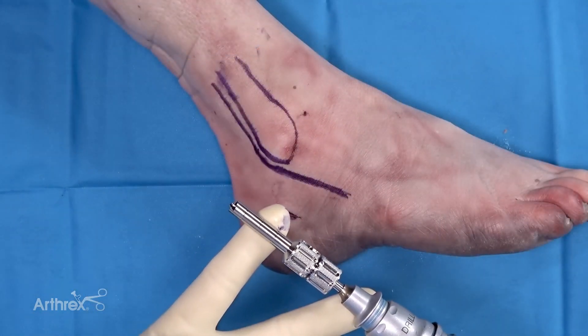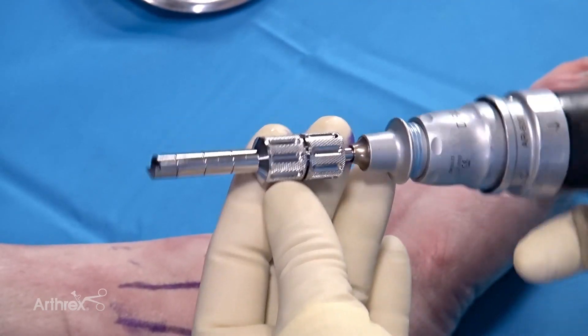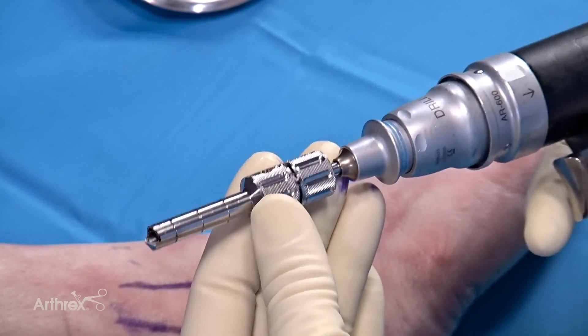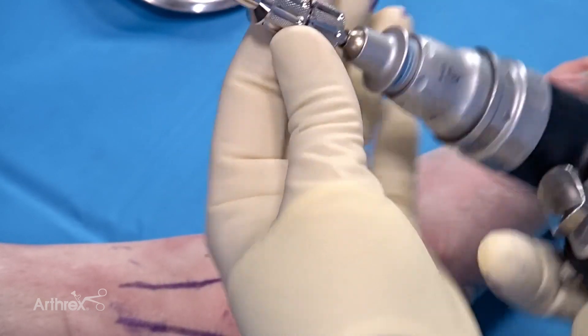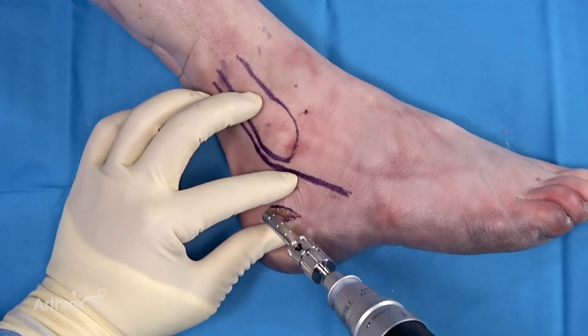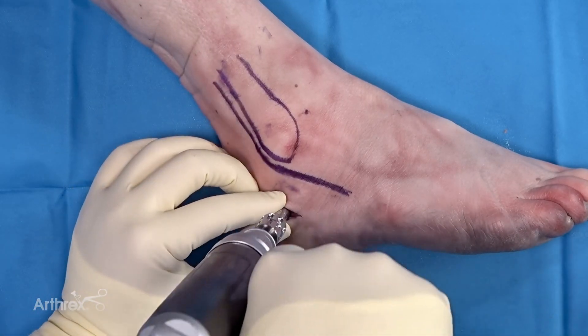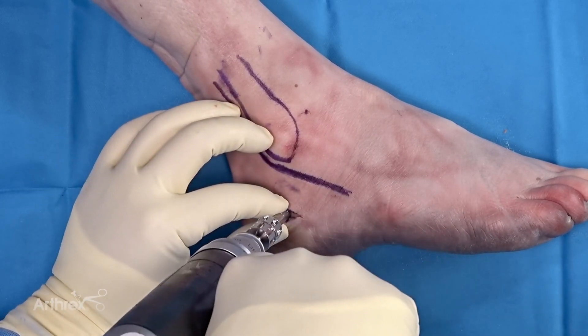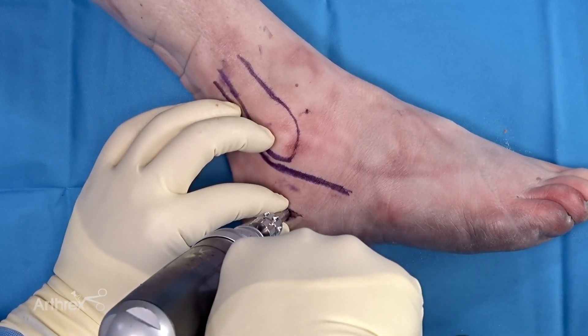Here we have an 8mm harvester loaded up. Of note, this does thread on clockwise. You want to keep the power going forward at all times and not reverse it, both to keep the components together as well as to continue collecting graft based on the auger tip. We pick our insertion site and this will remain our corticotomy site for the calcaneus.